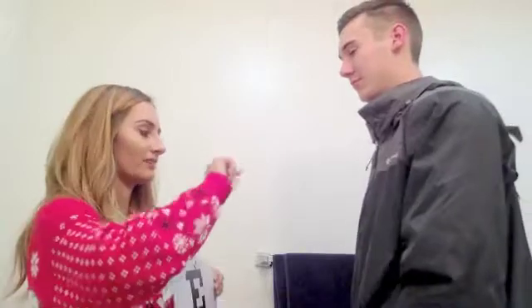For the purpose of this video, we're not going to do that just because we don't have the distance of 20 feet to record it, but we can have him pretend like we're going to do it. We will have them occlude one eye first, and then we will do the other, and then we'll do both at the same time. So we want to check each eye and then do both simultaneously to check the visual acuity. Okay, we can just pretend to be 20 feet away and scoot back a bit.